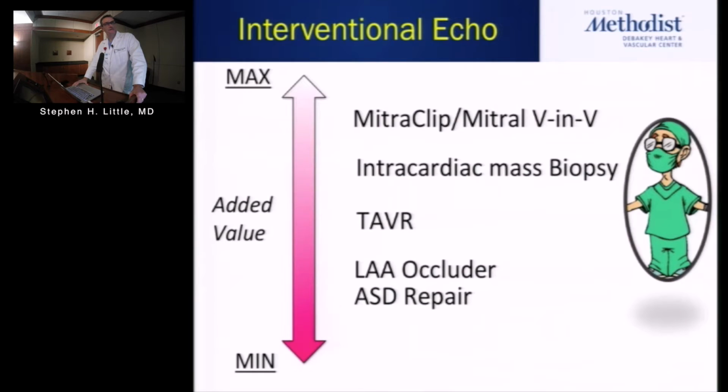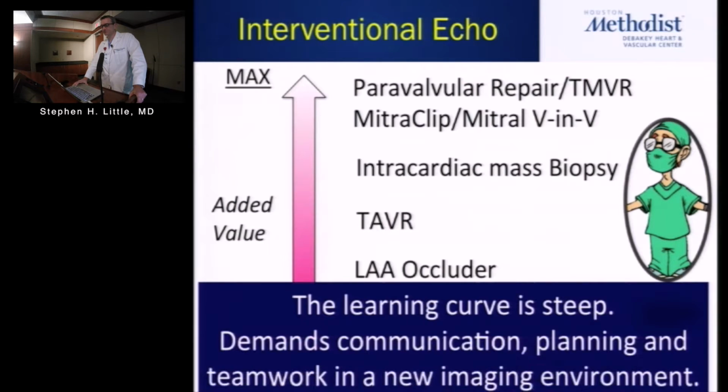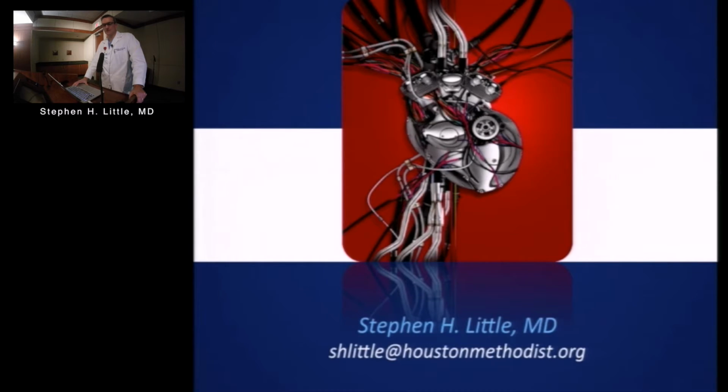But the high end of the added value is really MitraClip or mitral interventions. MitraClip, valve-in-valve, as I've shown you, but also paravalvular repair and transcatheter mitral valve replacement, absolutely. So it's a steep learning curve with lots of communication, but it is an example of teamwork in the new environment. So I'll stop there and take some questions.